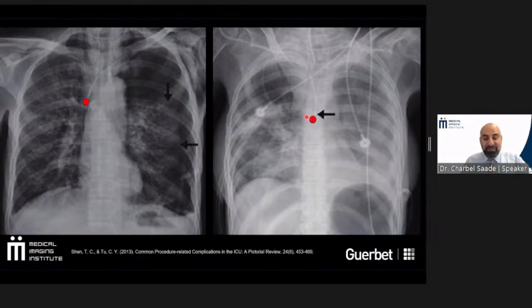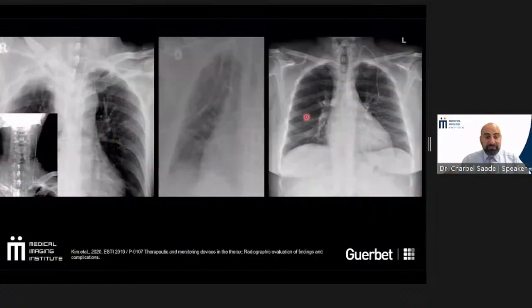So this is something we have to be careful of when we're injecting. And just because you have the x-ray before does not necessarily mean it hasn't moved when you do the scanogram or the topogram or the tomogram. Once it's there, then you know exactly what you're dealing with.